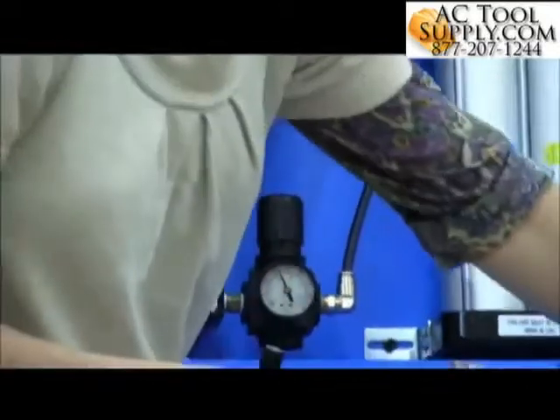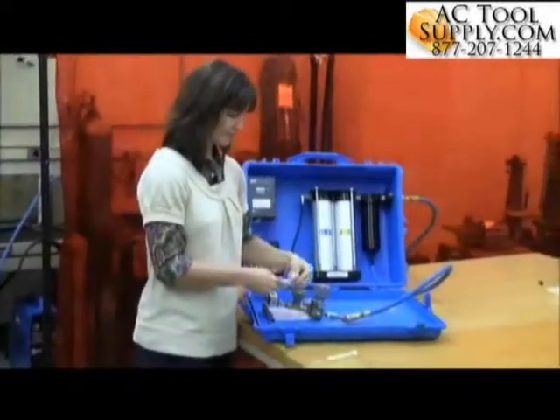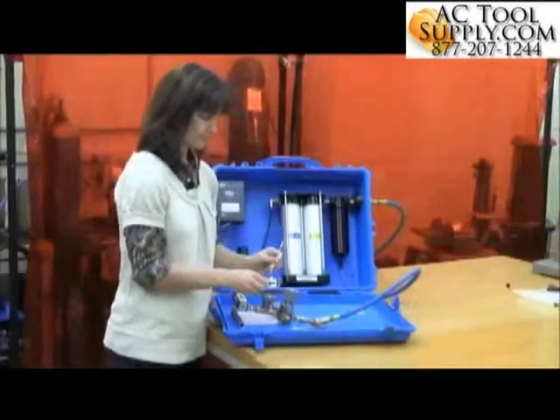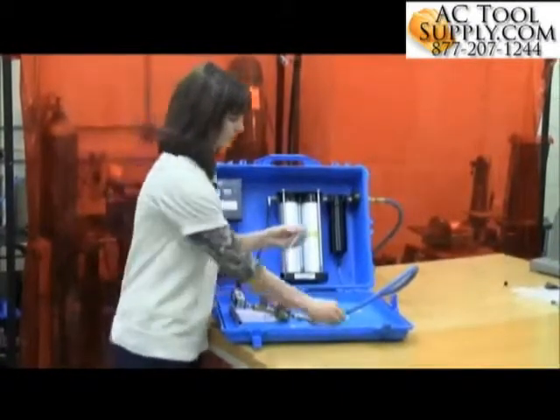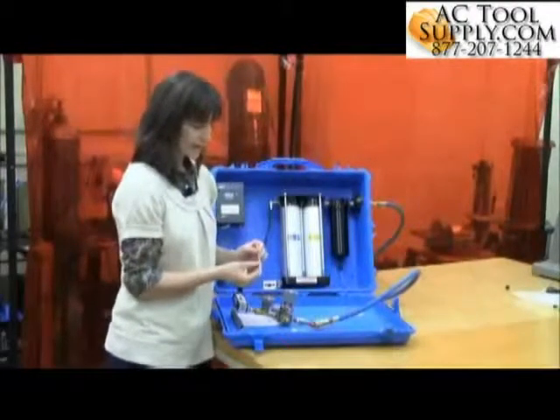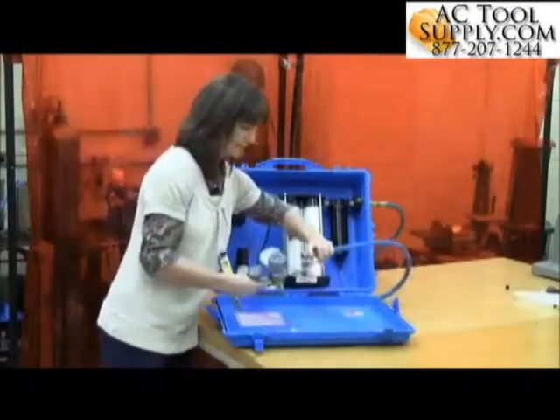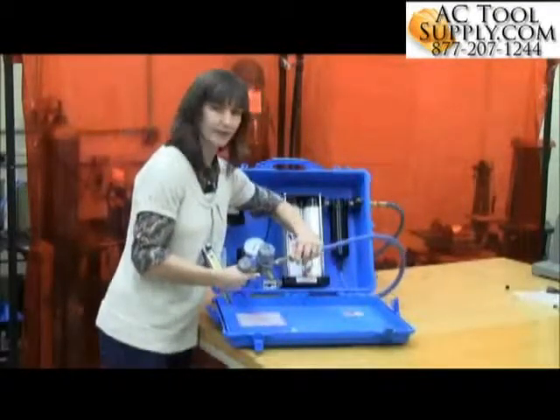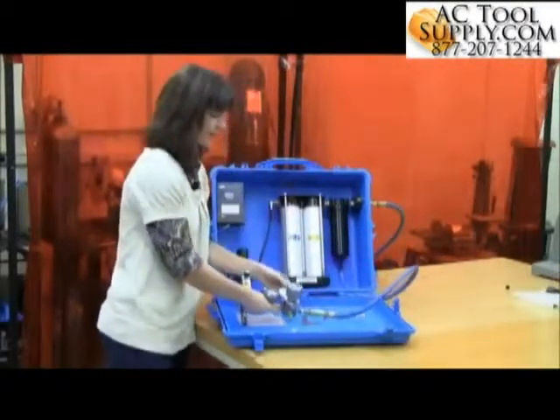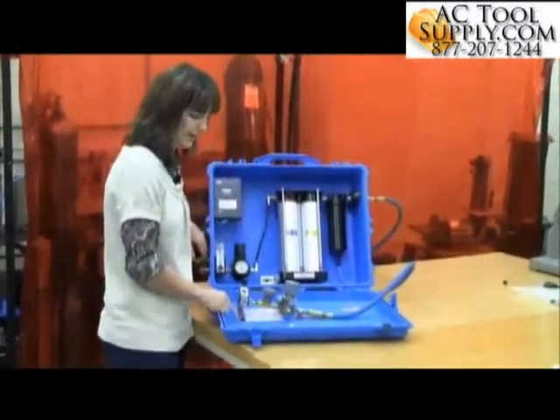To use the colorimetric test method, you'll take the tube and break both ends off. You'll notice the tube has an arrow on it that indicates the direction of airflow. Then you'll hook the tube up to your supplied air — connect the regulator to the end of your supplied air hose, or you can hook the regulator up to the quick connect at your filter and regulator panel.